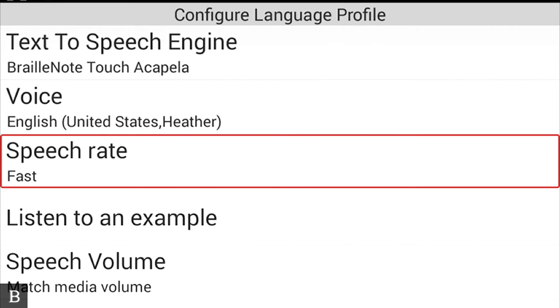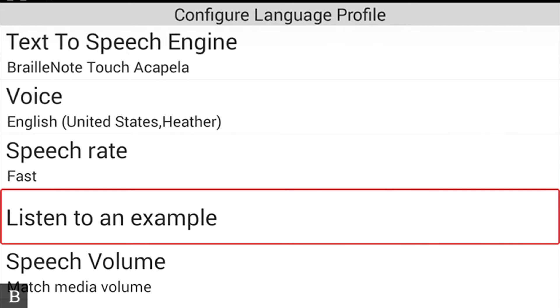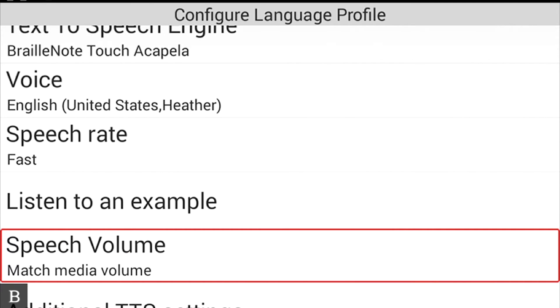The next setting is Speech Rate, currently set to fast, which is pretty reasonable. You can also listen to an example to hear what a given speed sounds like. After that is Speech Volume, currently set to 'Match Media Volume,' meaning the speech volume matches the media volume — so if music is playing softly, the speech will be at the same level.